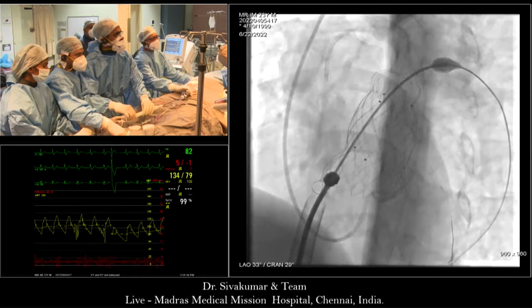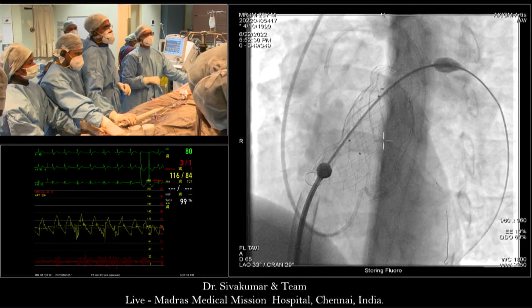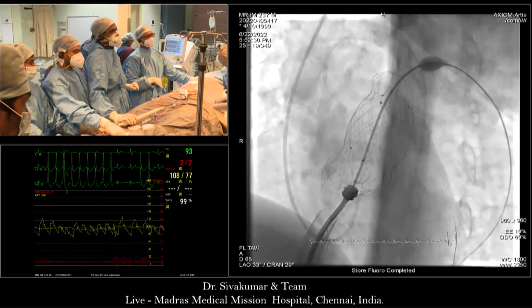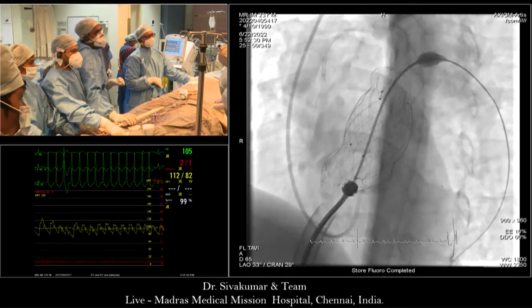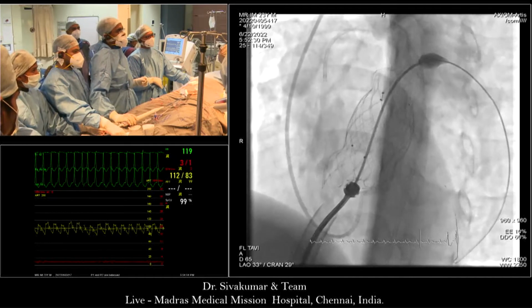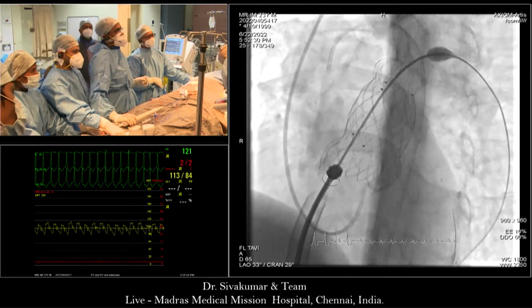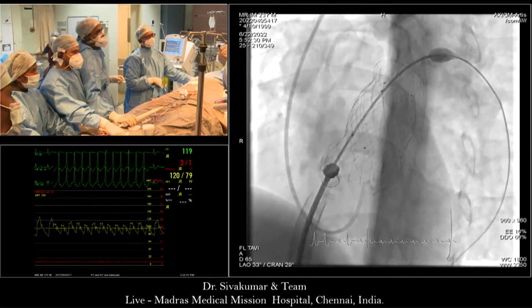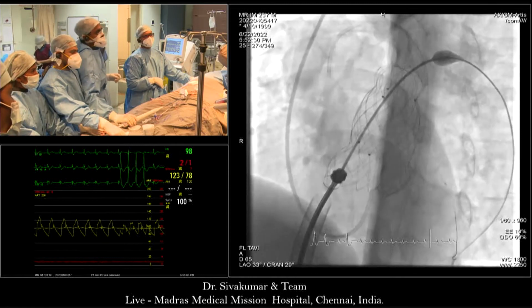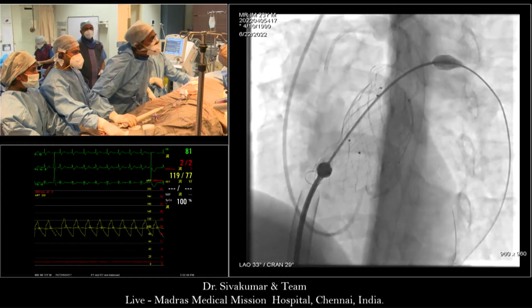I'll store that, because again, that's educational, and play it again. You see, now we are actually releasing. You see that it is still not released. I am now slowly pulling the gold ring back. There is a change in the configuration. And now at this position, once again, let me see whether I am seeing the ears.